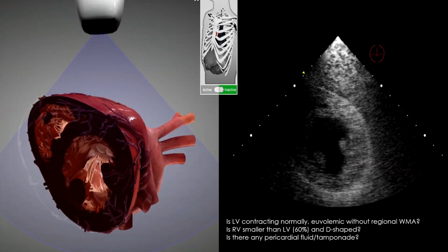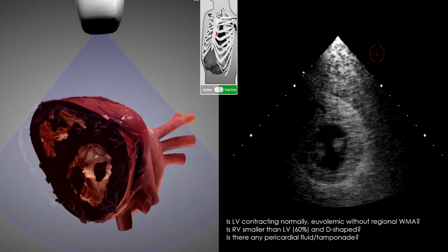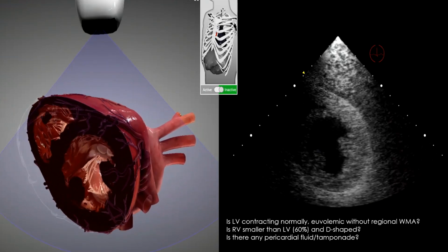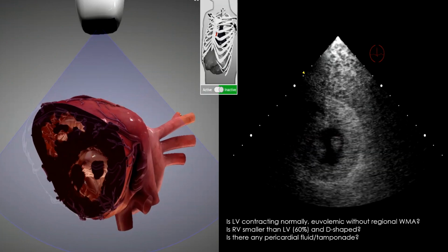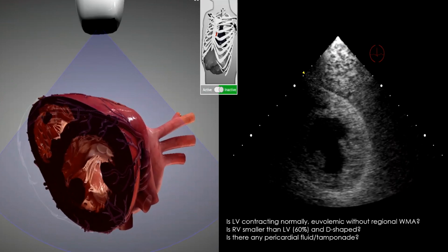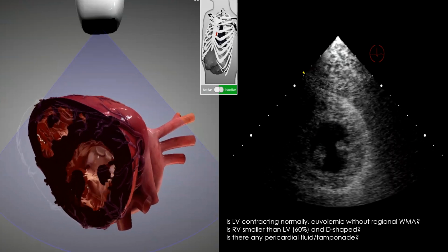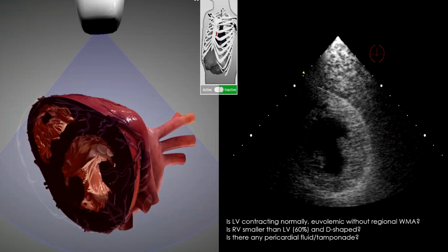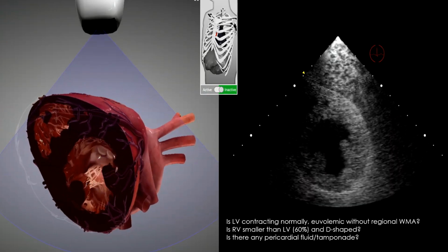And here's a different view of the short axis, but what you've got is papillary muscles here in this 3D image, and over on the right you can kind of see the 2D image. The thing you look at is whether the LV is contracting normally. Literally, I put my finger right in the middle of the screen and I watch the walls contract toward me. If I've got good wall motion towards my hand, I know that I don't have any infarction or ischemia, and if not, I know I've got a regional wall motion abnormality. And then if my EF is 50%, it's great. We're not trying to say, oh my goodness, the EF is 47.6%. We're trying to say good or bad, yes or no, black or white: ephedrine, neosynephrine, volume, no volume, things like that.